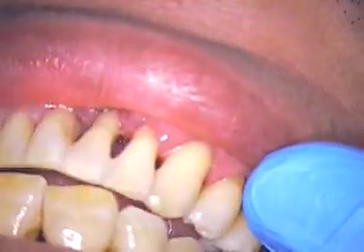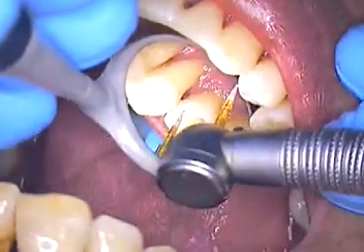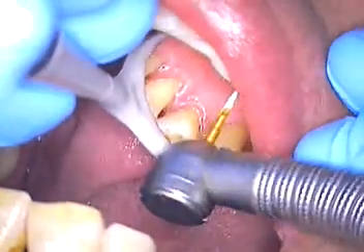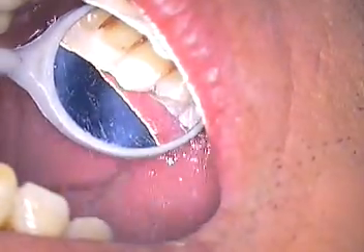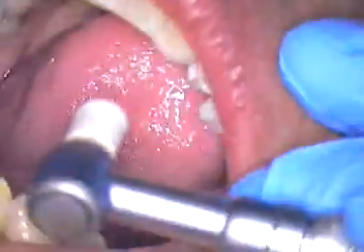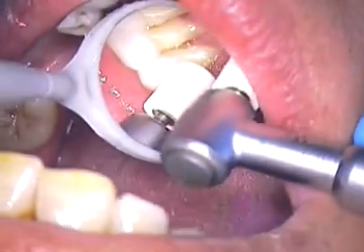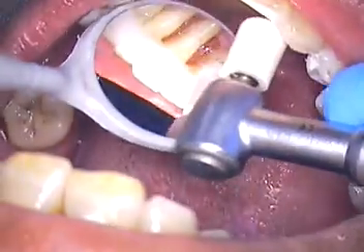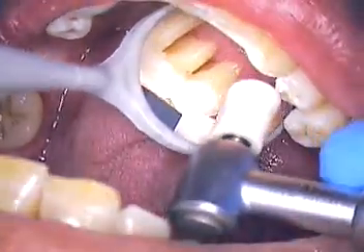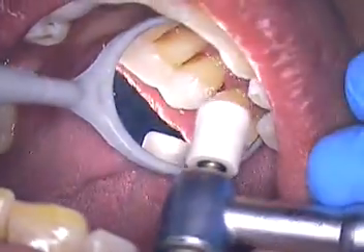Go ahead again. Still there. I can only figure one thing — it might be the adjacent tooth. You've got to be careful about that because there's a cusp tip sticking up there. Put your finger where it is. That's that tooth right there. All right, I'll keep adjusting. Let me see if I can polish that out of there. This is Dr. Jerry Cuomo. We're finishing up on this case. So we'll see you with the next case — great success. Maybe in a week we'll take a short clip just to show you what it looks like in one week. Take care.